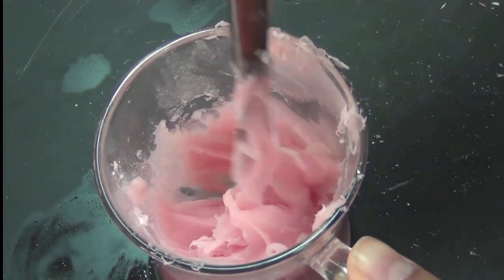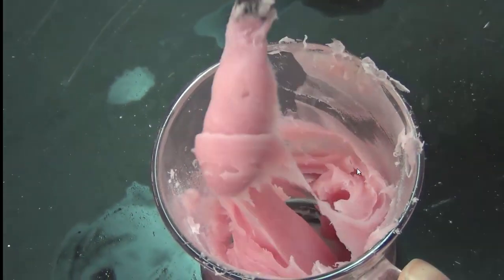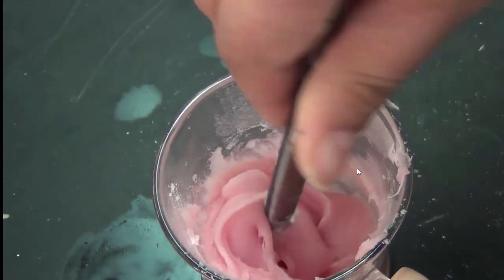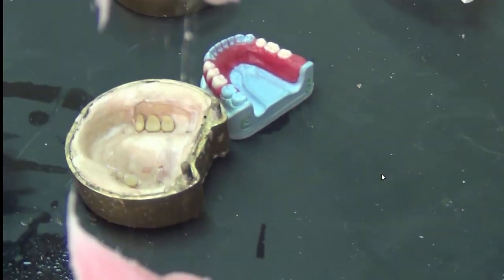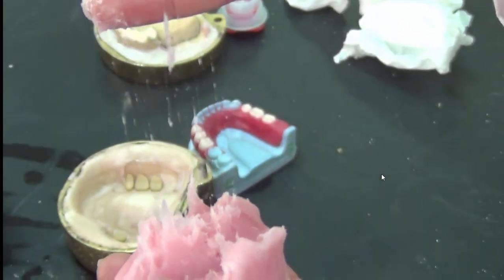Now we are almost at the end of the stringy stage, but notice that the amount of material going to the wax knife is less and it's coherent with each other. It's beginning to gather with each other. So we are in the beginning of the dough stage. Okay, I'm going to show you more of the stringy stage. We removed it at the end of the stringy stage, but see the strings? The strands of the acrylic, as if it's a spider web. So this is the end of the stringy stage. We're going into the dough stage.